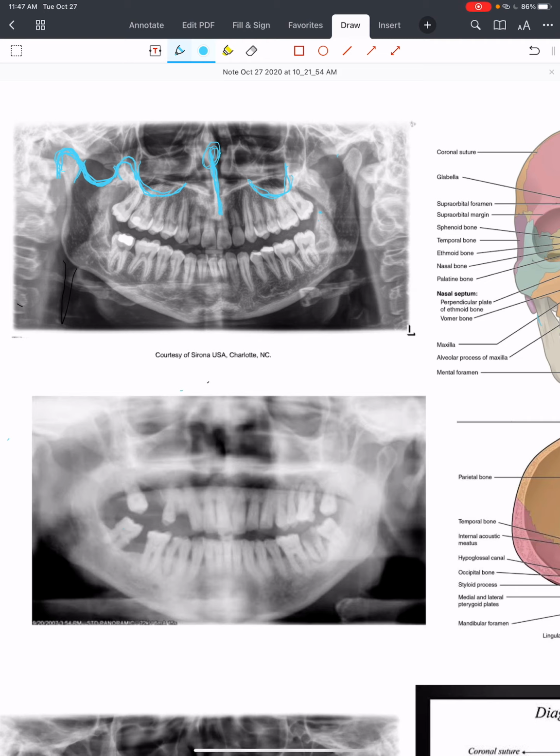on this image compared to the rest of the images, we have a really nice view of the cervical vertebrae, and these were going to appear as radiopaque, almost plate-like. You can't miss them. You'll know what it is when you see them. In outlining the cervical vertebrae, we're going to have the posterior pharyngeal wall.